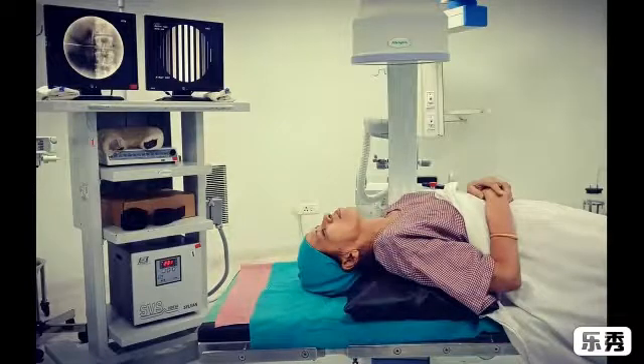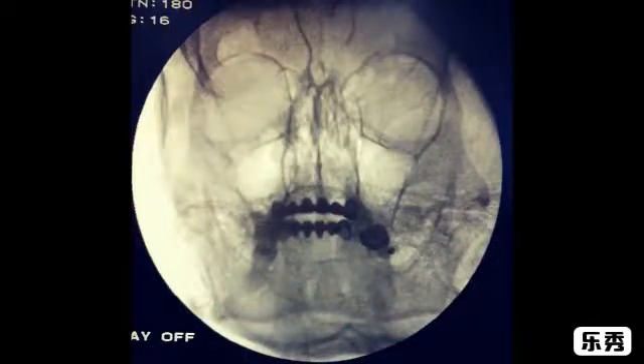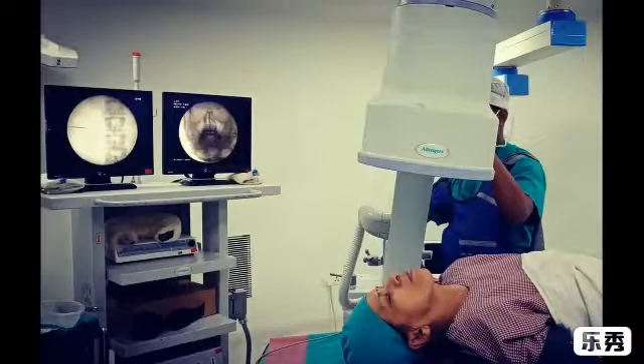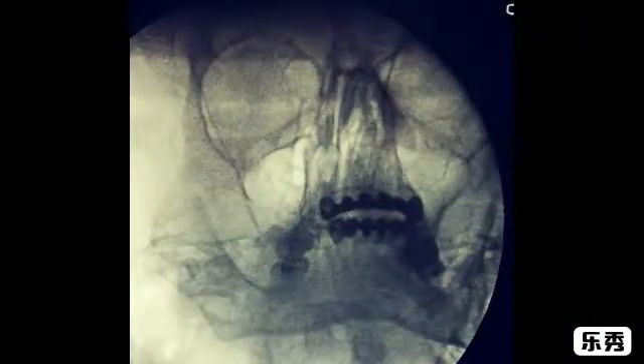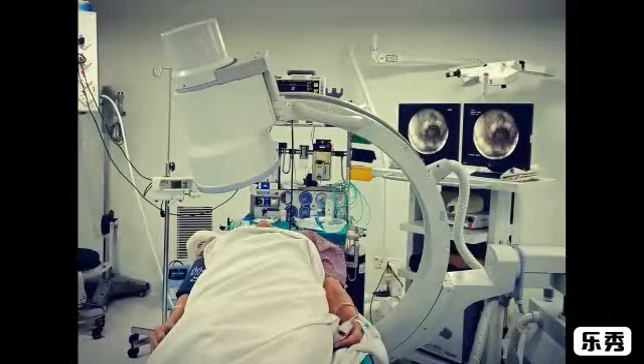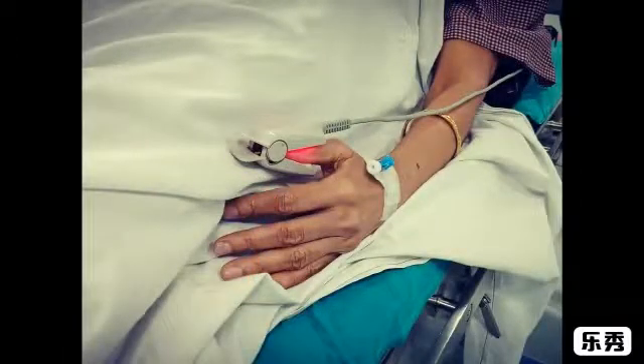The patient is given position with a pillow below the shoulder. In AP view, you can see taking the C-arm at 20 to 30 degrees. Then the cephalocaudal submental view is taken, and after that the C-arm on the affected side at 20 to 30 degrees lateral, so that we can focus the foramen ovale just beside the ramus of the mandible. You can see the foramen ovale — that is the target. Now putting IV line and monitors.